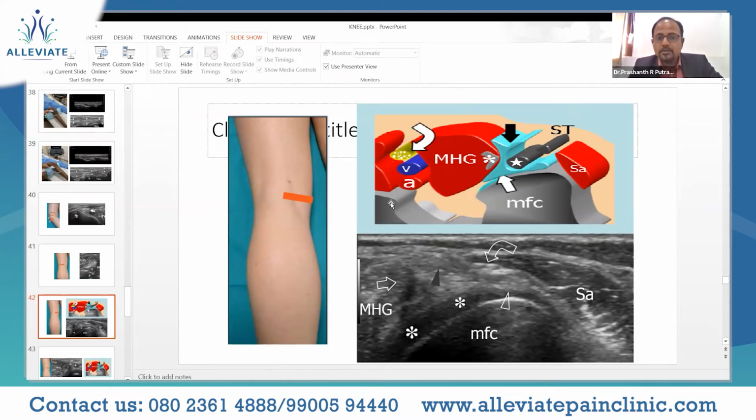Then you would be able to see the muscle belly of the medial head of the gastrocnemius in this area. And more importantly is what is marked in blue over here. It's a bursa. Again, there's a location of a bursa. If at all it was positive, then there would be a fluid collection in this region as a crescent-shaped structure over here.